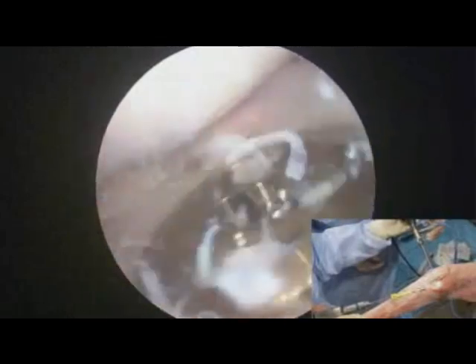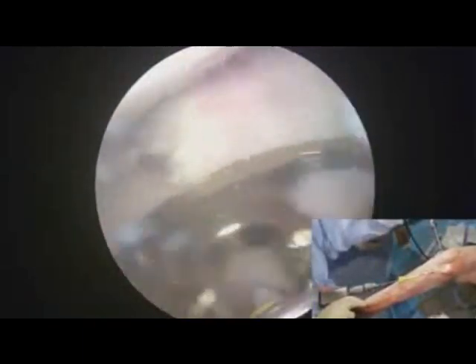I'm going to go reverse just to get the thing centered, get some of the articular cartilage that may be around off. And once we're started, then what I do is I just go in an anterior position, and then I want to just pull in line back towards myself, and it starts to cut. And you can hear it just starting to cut the bone there. I'll show you there. You can see it's just starting to cut a slot.